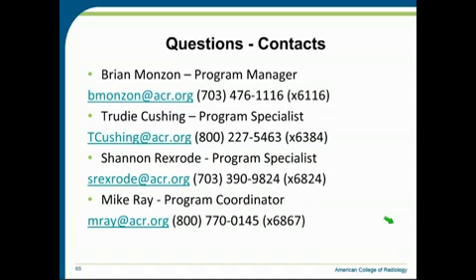I think Mosaic has a better prescription page. If there's a comment section in ARIA, I would utilize that. So I have up in front of me my Mosaic, and I have treatment technique, and I have 9-field IMRT, but in the comment section I have my beam angles listed.